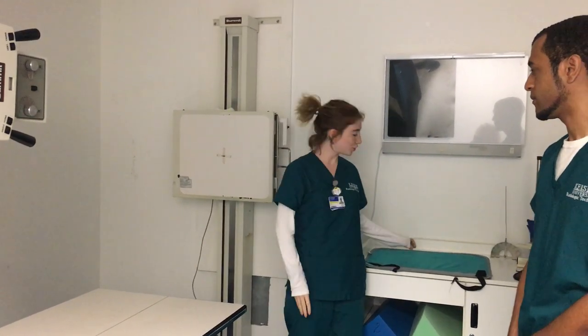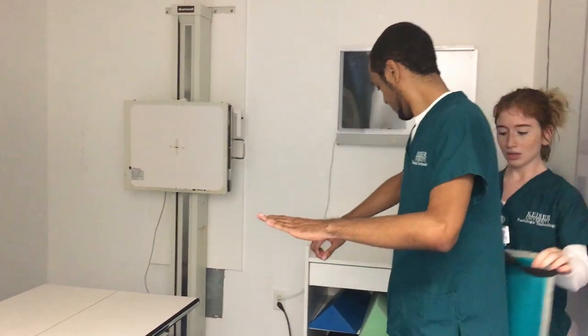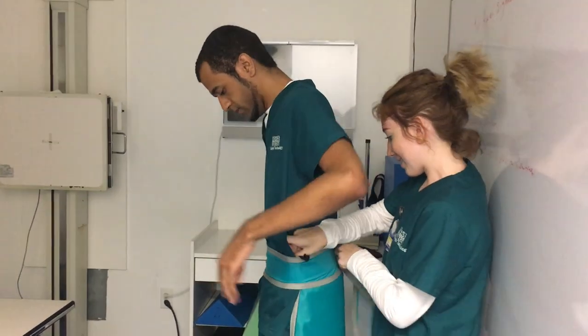I will now put the shield on the patient to decrease radiation exposure. Could you bring the strap around to me? Thank you.